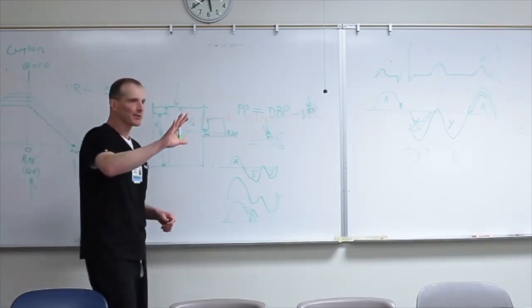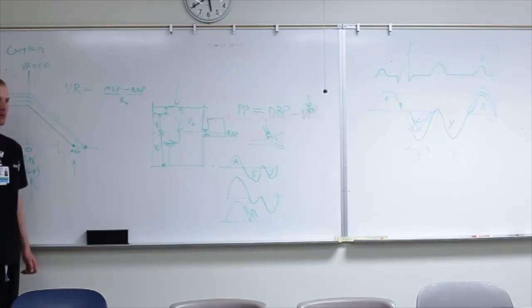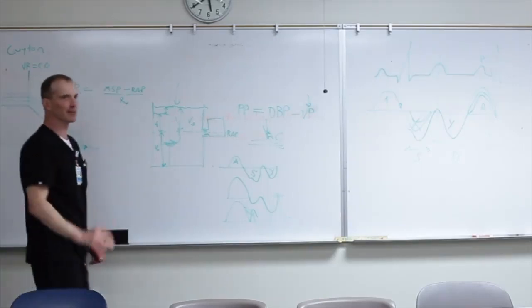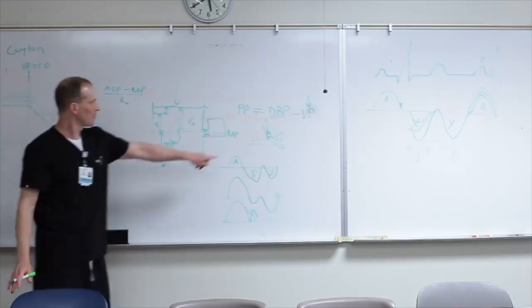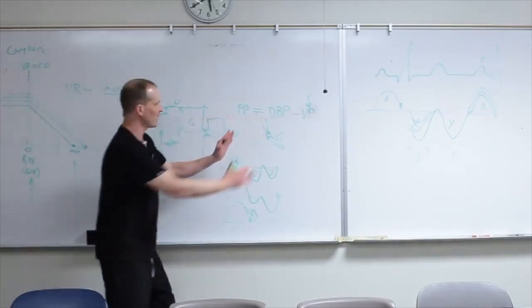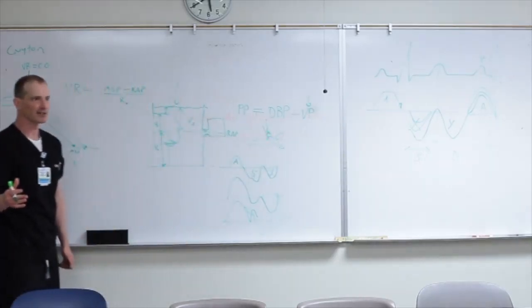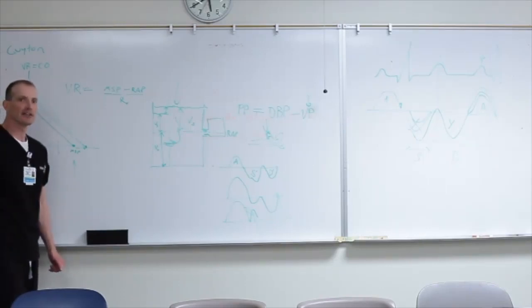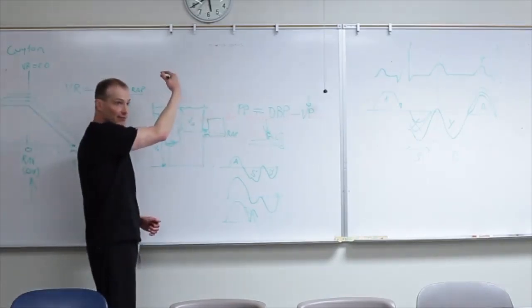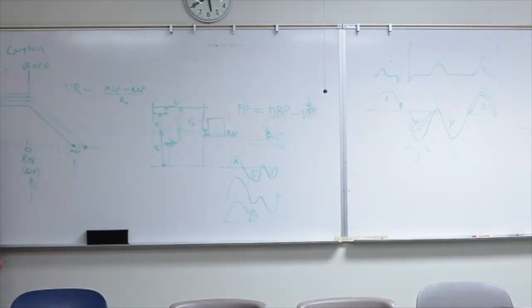And if you put a color Doppler over someone with high right atrial pressures, because red is toward the transducer and blue is away, you'll go blue, red, blue, red, blue, red if you have really high pressures. Okay? So that's a quick and easy way without dropping a pulse wave Doppler, which can be hard. You just put the color box over here. And if it goes blue, red, blue, red, blue, red, that's high right atrial pressures. You're already going to have a hint because your IVC is going to be big and fat anyway, but you know that it's getting transmitted backwards up into the liver when you see that blue-red alternating pattern. Okay?